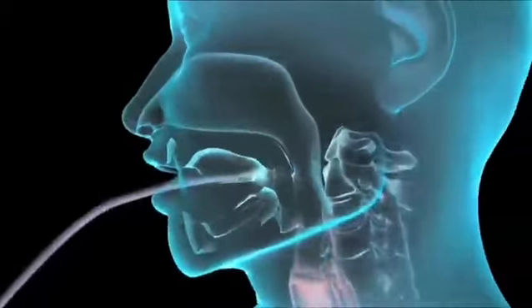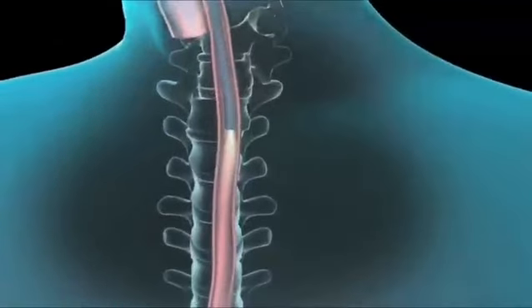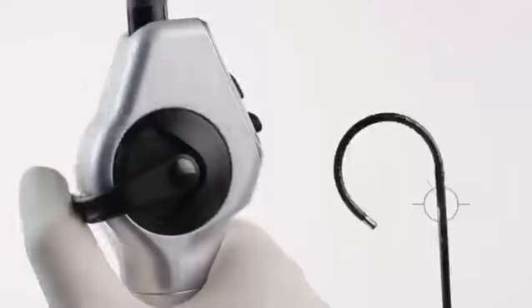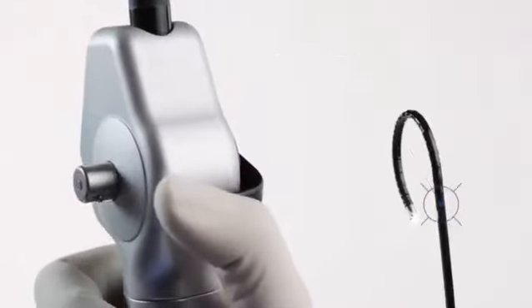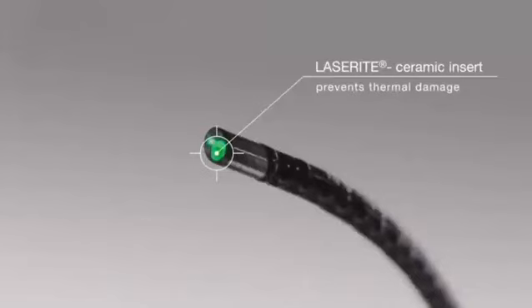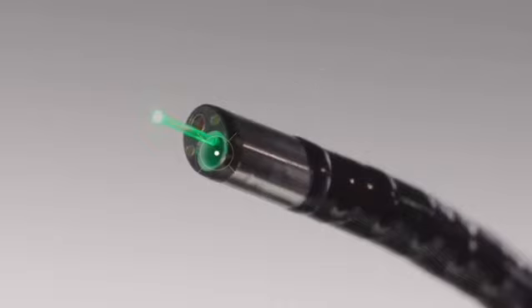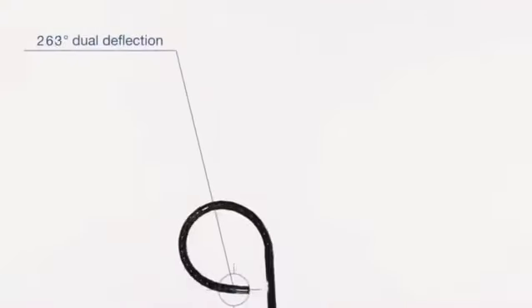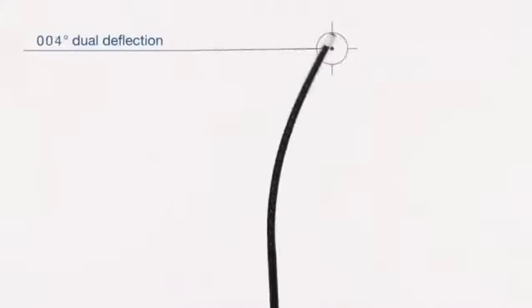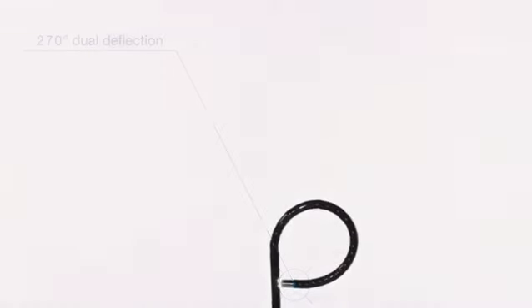The modern flexible endoscope is a complex, highly engineered medical instrument. Systems for air, water, suction, tip angulation, and the endoscope's basic controls are common across manufacturers and models. Differentiation is often in handling characteristics, breadth of product line, image quality, and the manufacturer's special features: insertion tube flexibility adjustment, image enhancement features, image documentation options, etc.